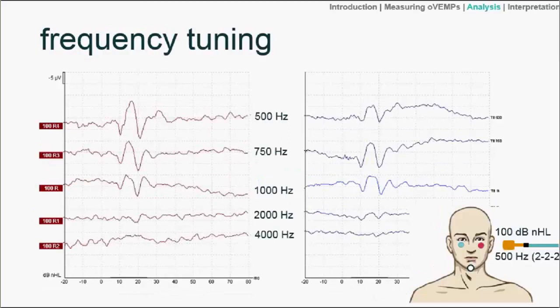So it'd be rarely below 80. Another parameter would be tuning, frequency tuning, and we'll mention the relevance of this in a few slides' time. But plotting the VEMP at a fixed level, but changing the frequency of the sound.